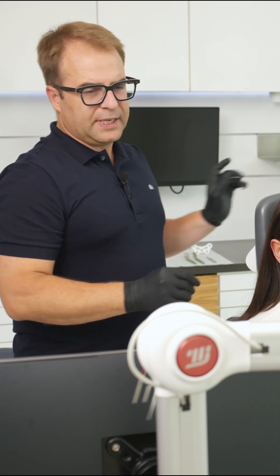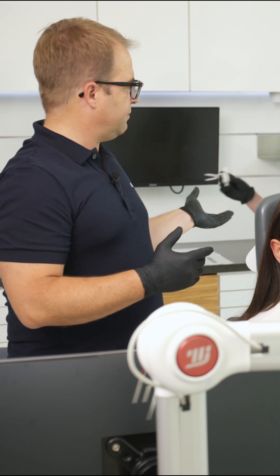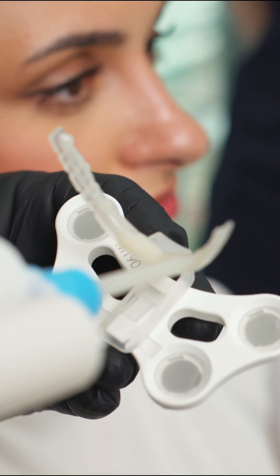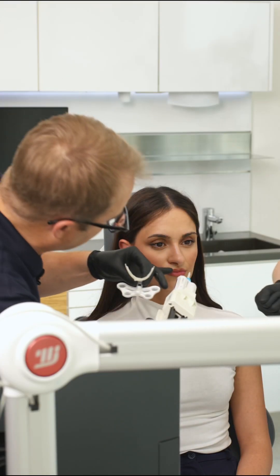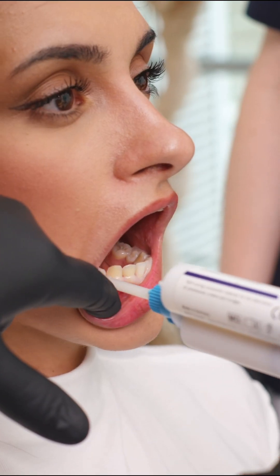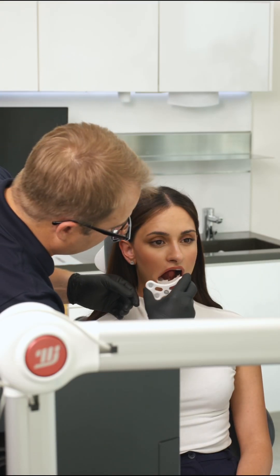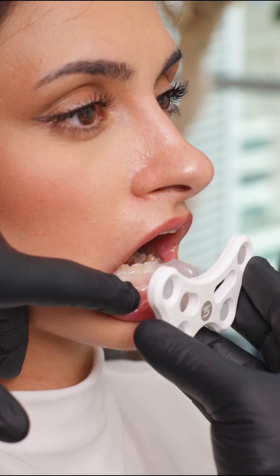The next step will be the Smilet attached to the bite fork. I put some of the material here on the fork, and then here on the outside of the lower jaw. And now I'll put the fork here on the jaw.